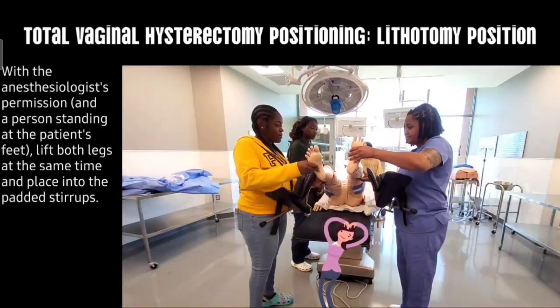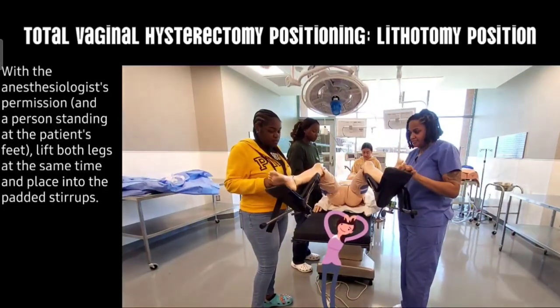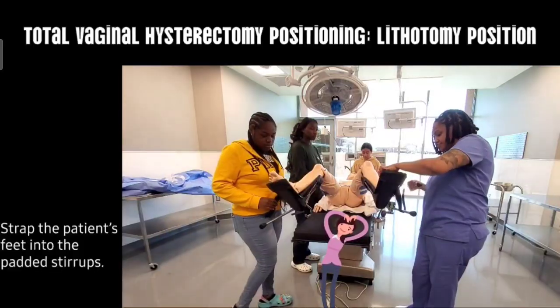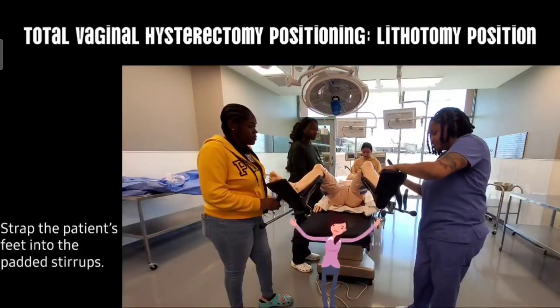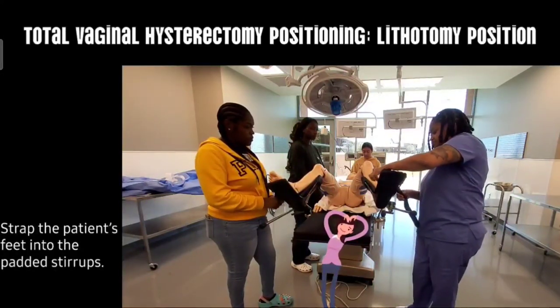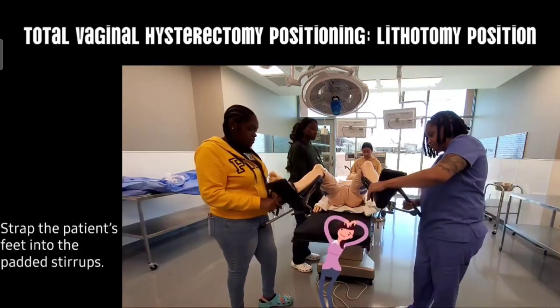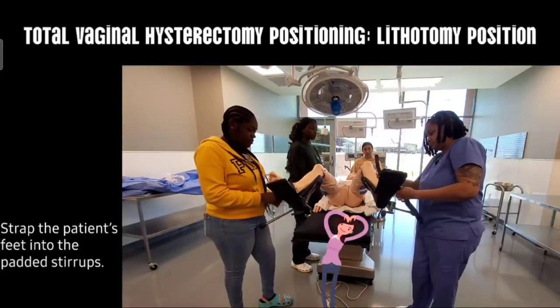The choice of the positioning depends on the body areas that need to be accessed, the potential risk to the patient, and precautions required to prevent injury, and the surgeon and anesthesia provider's preference. To minimize the strain on the body, the patient should be slowly returned to the specified position after surgery, giving the body time to adjust.